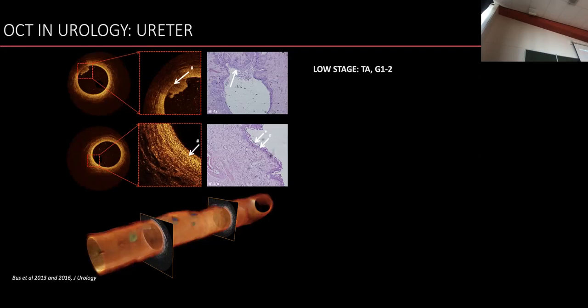If you encounter a lesion that is suspected for cancer, it might look like that. Up there it is a tiny growth into the lumen. What you can also see there, and let me point it out with the mouse, is this layer where the arrow is pointing, and this layer is continuous. From a clinical point of view, this is very important. If a lesion did not yet grow into the tissue itself, this layer is still continuous, which we call the basal membrane. It's a layer in between the epithelial cells and the muscle cells. When the lesion is still just present in the epithelial cells, it has not breached through. It's not what we call an invasive tumor, but a non-invasive, non-muscle invasive lesion.